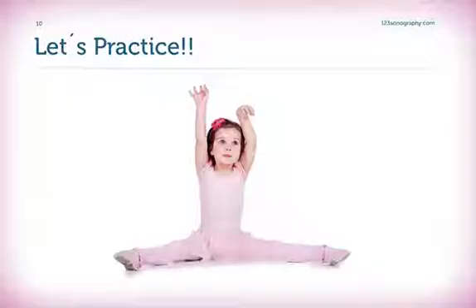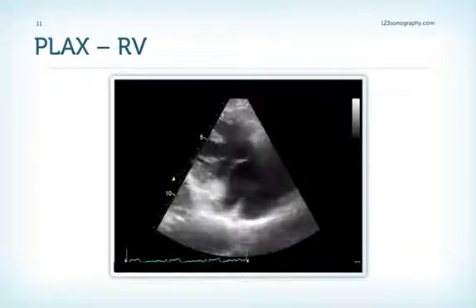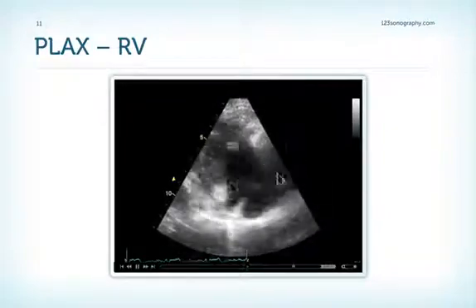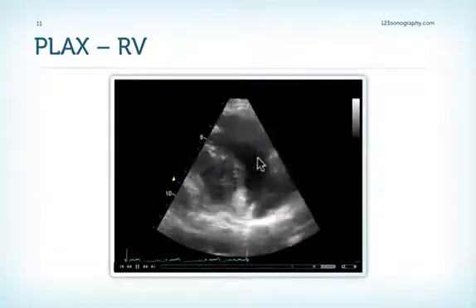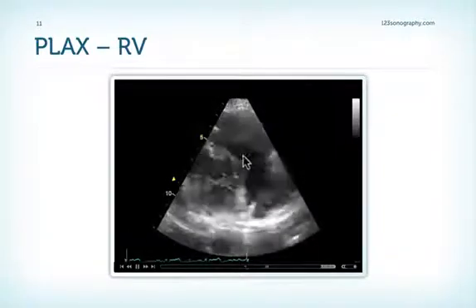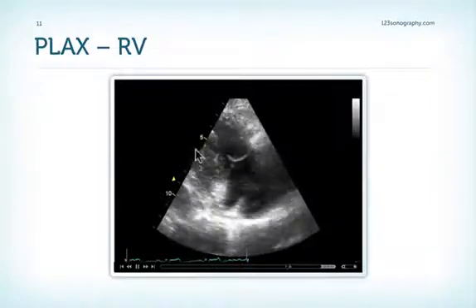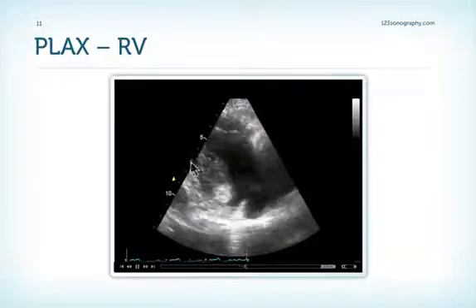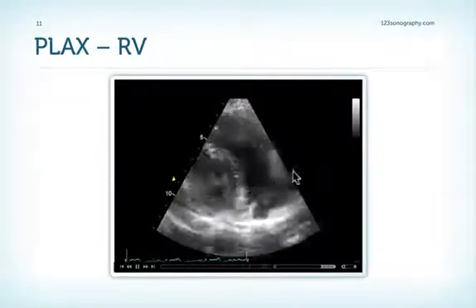Now it's time to practice. Here is a parasternal long-axis view of the right ventricle with the tricuspid valve visible. The question is: which leaflets do we see? We have the anterior wall of the right ventricle, therefore this leaflet must be the anterior leaflet. This part adjacent to the septum — since the left ventricle is also in the field of view — is most likely the septal leaflet.